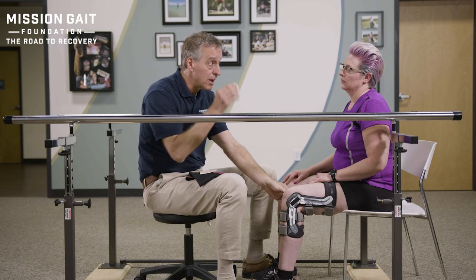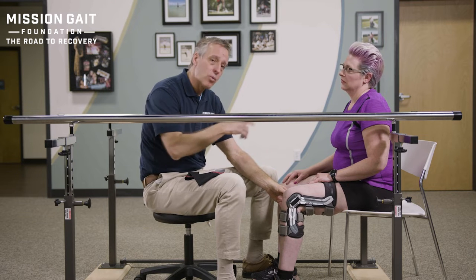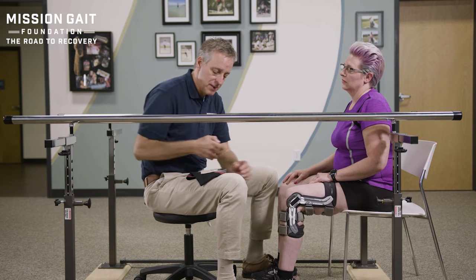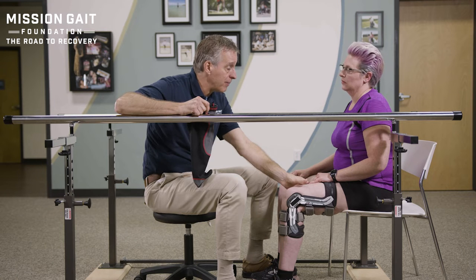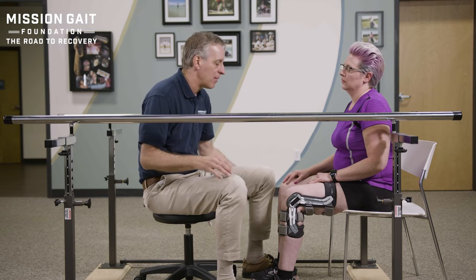You lose a little grip with the sleeve, so the brace could slip more — if you're a quarterback on a football team, you'd want that rubber grip. But if you're walking around and most activities aren't at that high level, the sleeve is much more comfortable. There is also a sleeve you can put under the brace first to protect your skin all the way up, though the brace will tend to slide down the leg more. People have to figure out what is most comfortable for them.